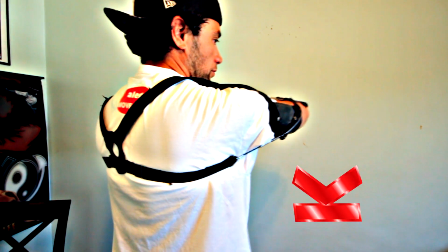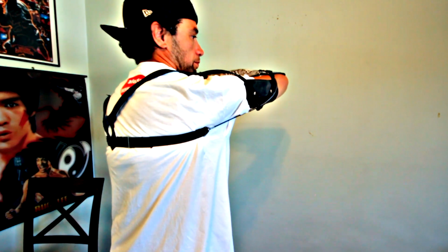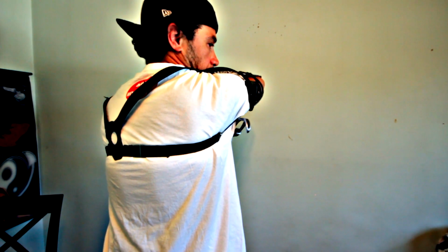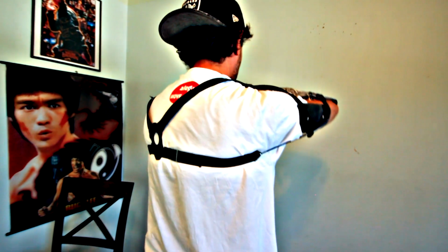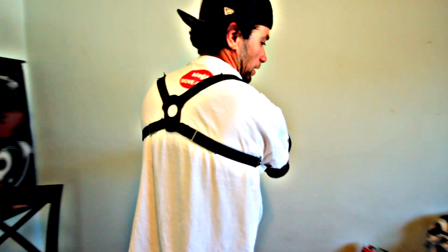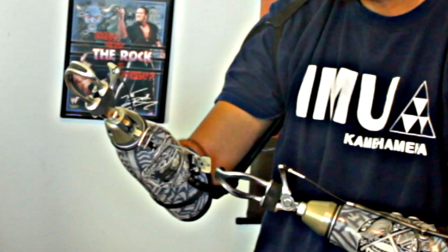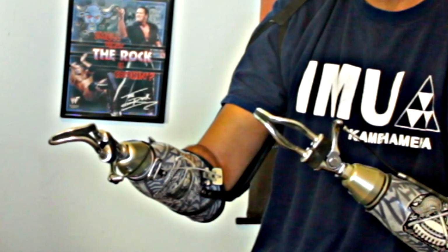I can also open it by just pushing out my elbows because it's pushing against this elbow and pulling against my back. So you can open it like that for things that are in close to your body. That's if you're a brand new user of these arms. And then this wrist actually has a spring-loaded wrist that when you hit it, it spins and then it locks.